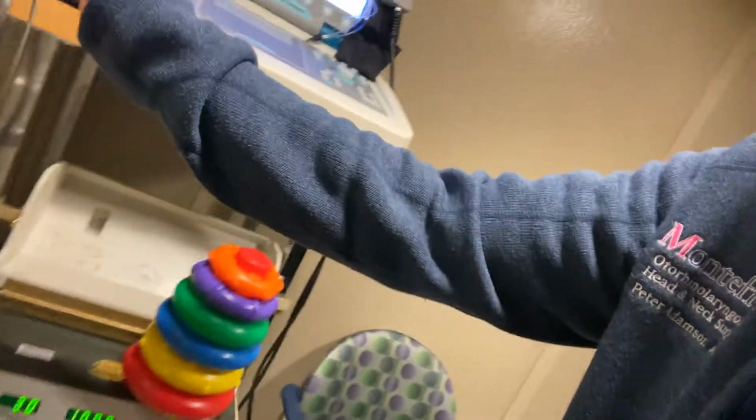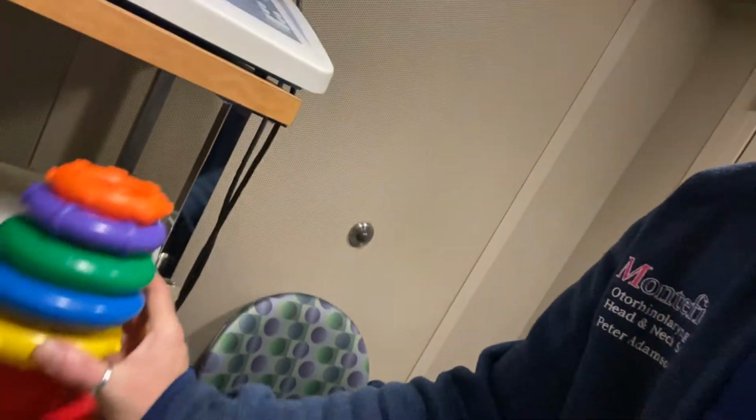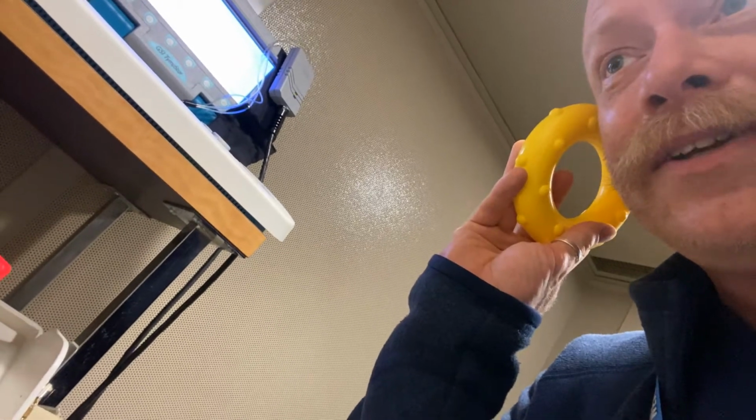I've got the child here, and I put the headphones onto the child, and I condition the child at, let's say, maybe 2000 hertz in the left ear, and I'll say to the child, beep, beep, beep, and with my hand, I'll put the ring onto the red dowel, and a nice loud thing. Tweet, tweet, tweet. Okay, and I'll say, do you want to try it by yourself? Okay. Tweet, tweet, tweet.